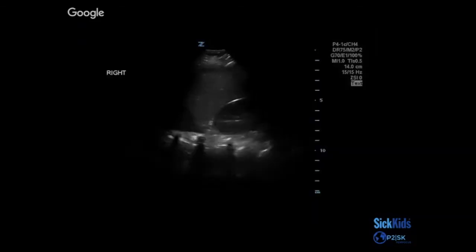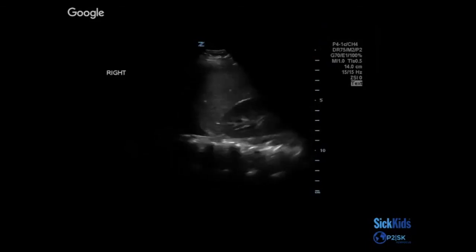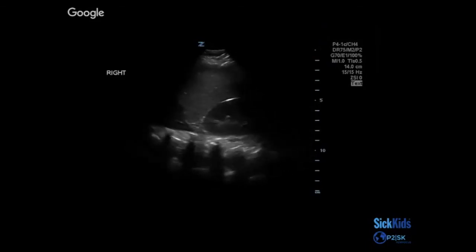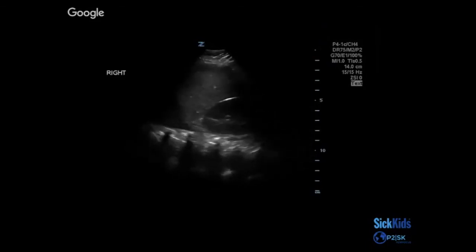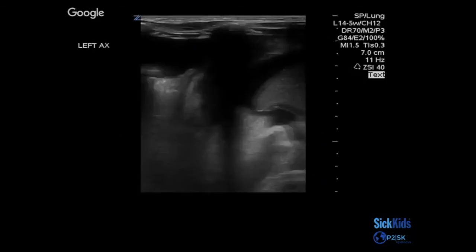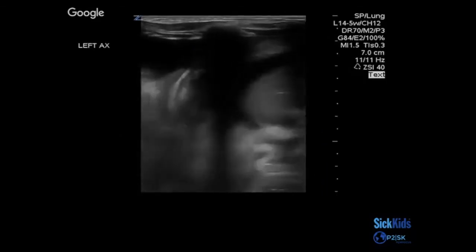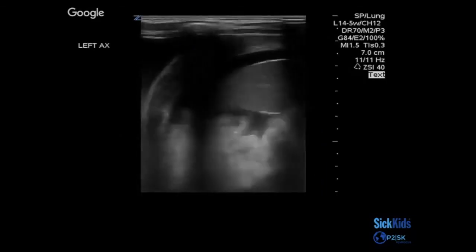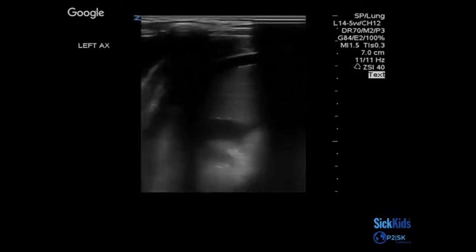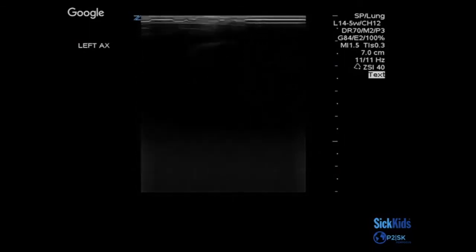Here's another example of the spine sign — that little triangle there to the left of the screen. It's also possible that when you scan, you see fluid both in the chest and in the abdomen in those multi-system traumas.